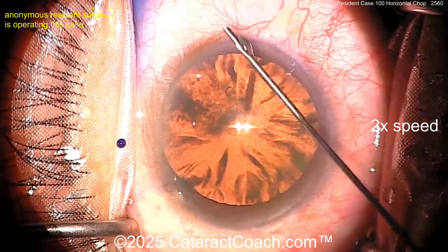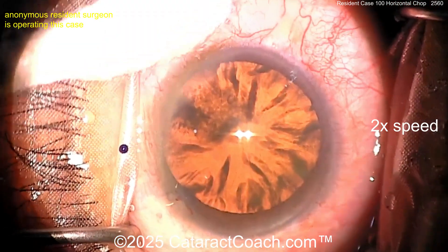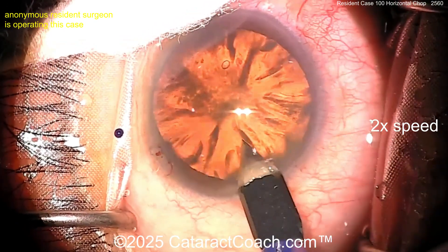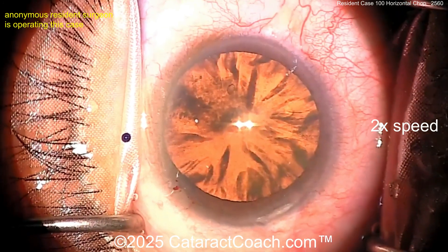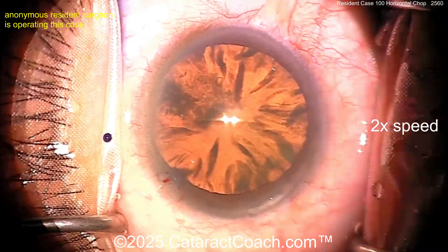Now it looks like the viscoelastic going inside — it's a good viscoelastic feel. I like how you check the pressure there; you don't want the pressure too high. If you have a very high IOP, the incision will be short. Now let's see the incision — that's pretty reasonable, I kind of like it.